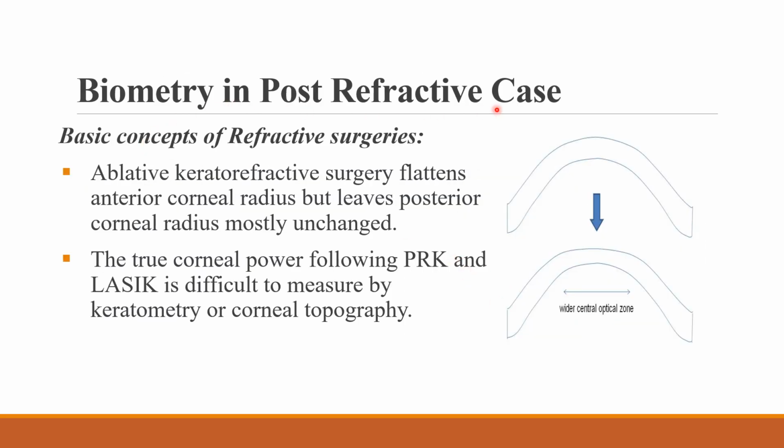Biometry in post-refractive case. Here we see the steep cornea and after ablation a flat cornea. Basic concepts of refractive surgeries. Ablative keratorefractive surgery flattens anterior corneal radius but leaves posterior corneal radius mostly unchanged.